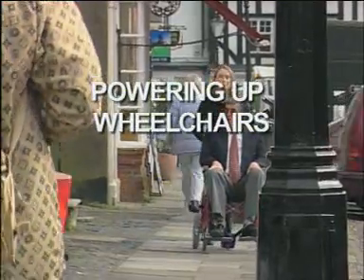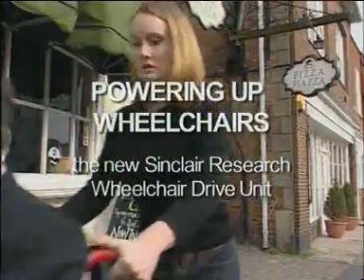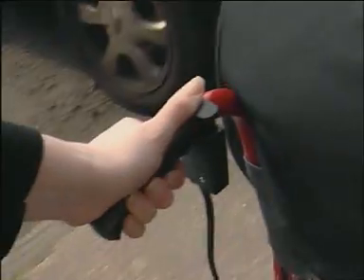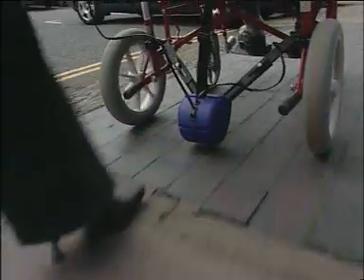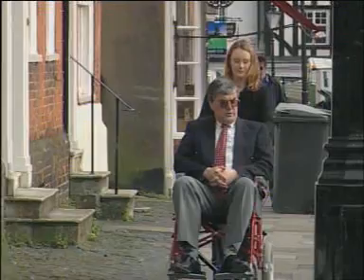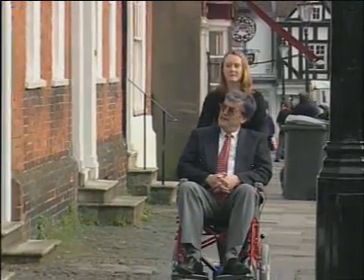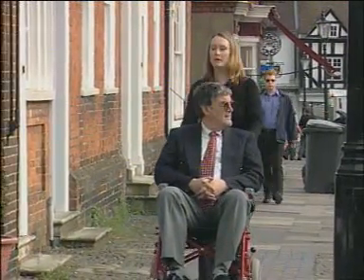You're looking at a conventional wheelchair in use on a typical street, but not quite so conventional as it may first appear. This wheelchair is specially adapted and it's the first of a new generation. Underneath the chair there's something very new: a wheelchair drive unit designed to provide electrically powered pushing assistance for most common domestic types of wheelchairs that are propelled along by an attendant, both folding and rigid chairs.